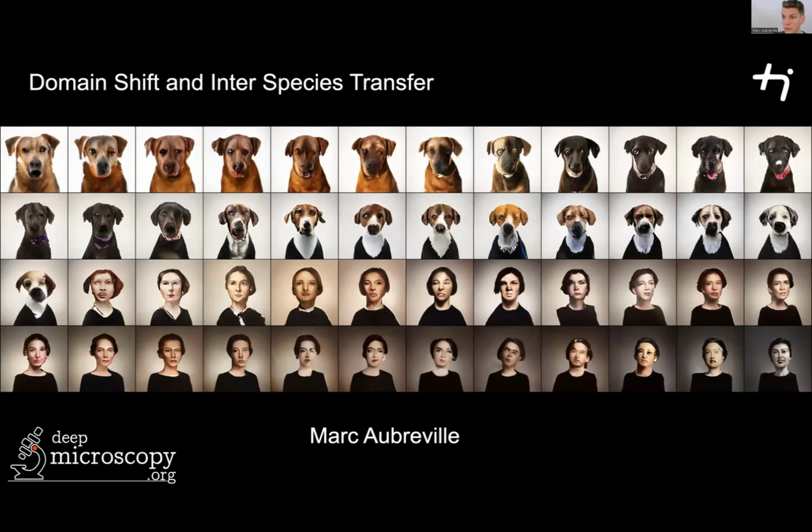Yes, we have some preliminary data on that. On whole slide images, you will typically go for approaches like weakly supervised learning. I think it very much depends on the stability of your features. What we have seen, and this is just an impression for now, is that some self-supervised pre-trained algorithms might be more strongly dependent on color cues, as you might expect. On the other hand, feature extractors like the ImageNet based ones are much more robust than we expected initially. We just had a molecular profiling run on whole slide images using different scanners, and it was surprisingly robust, without any adversarial training or augmentation or whatnot. Thank you.